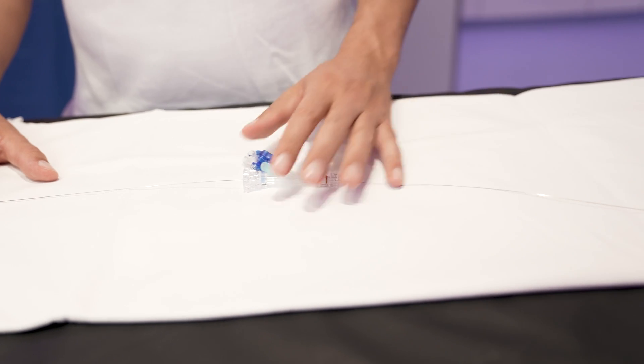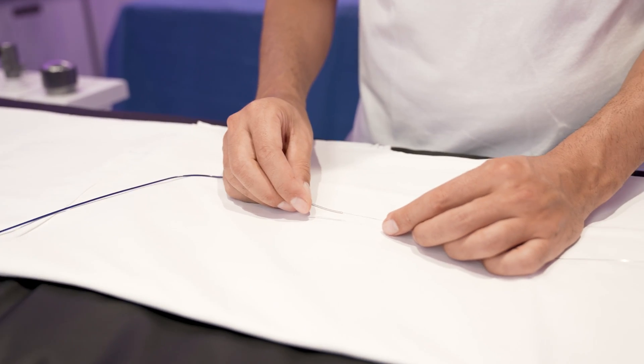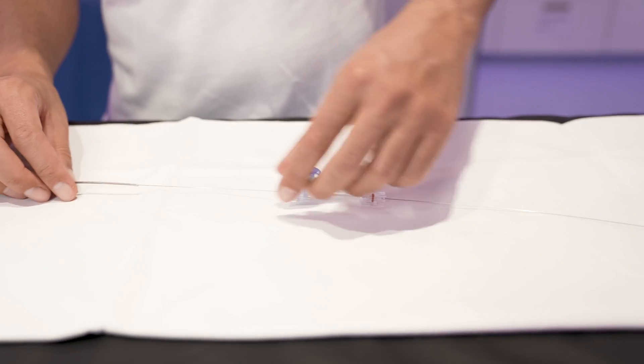So let's see on our ANGIA table how you are able to connect the wire and also disconnect it afterwards. This is your typical scenario: you have punctured the groin, there is a stent retriever in the brain, you have treated your cervical lesion with a stent and a balloon, and now you want to introduce your aspiration catheter towards the intracranial lesion to perform your thrombectomy. What typically happens in such a case is that you don't have any control of the wire, so you have to very carefully push the aspiration catheter, and even if you do this very carefully, you can see what happens — you actually push the wire towards the brain.